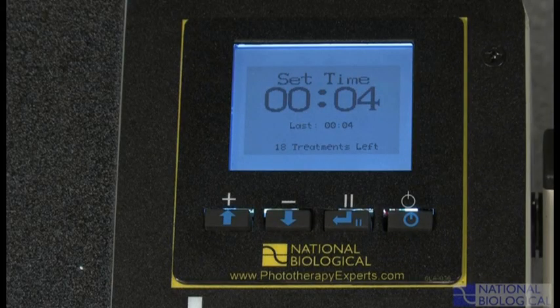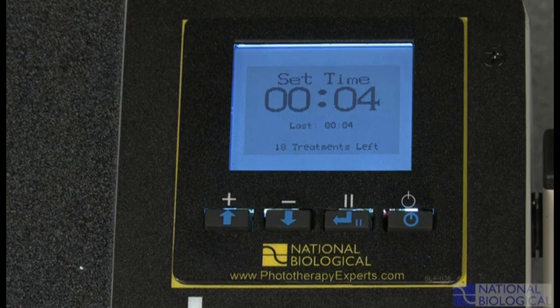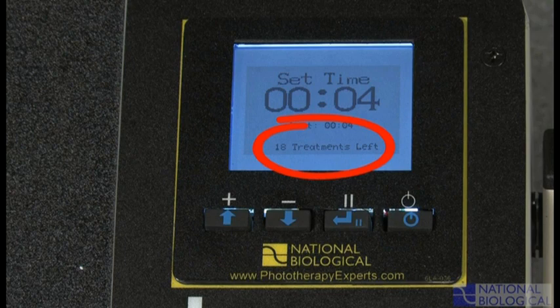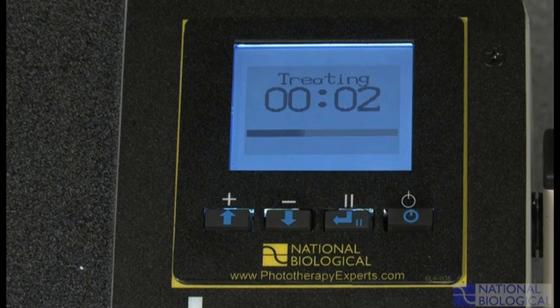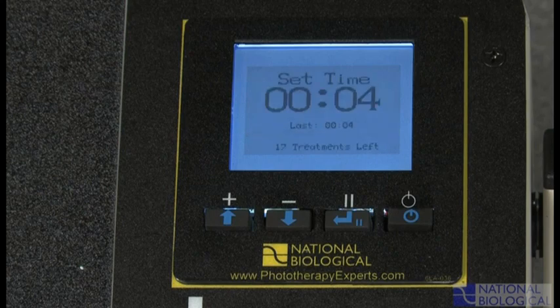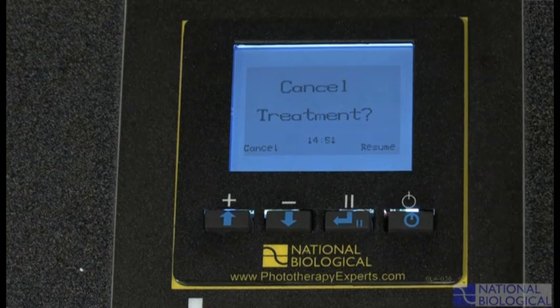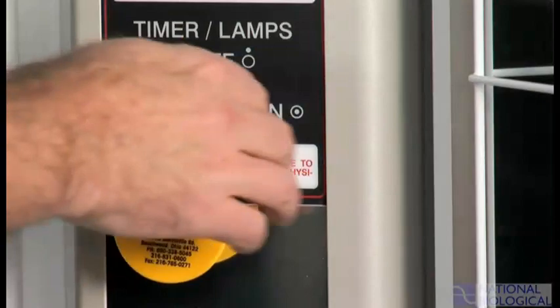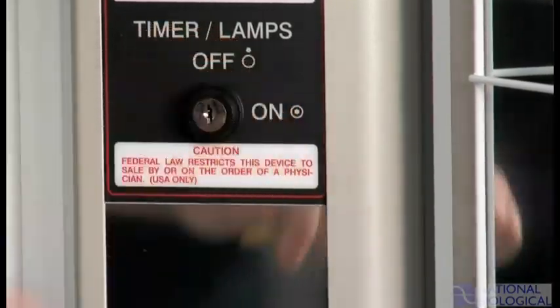Just like anything prescribed by your doctor, your phototherapy unit requires you to periodically contact him or her to renew your prescription. This unit is equipped with a controlled prescription timer that is preset to allow 150 treatments. The number of treatments remaining is displayed at the bottom of the set time screen. One treatment is subtracted each time the timer reaches the end of a treatment, when a treatment is canceled, or when the power is turned off using the key switch.